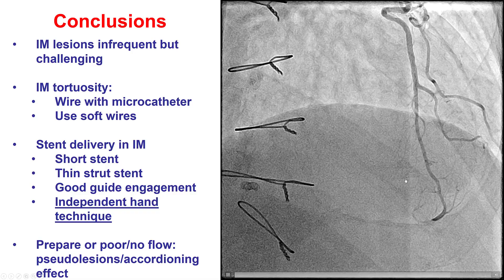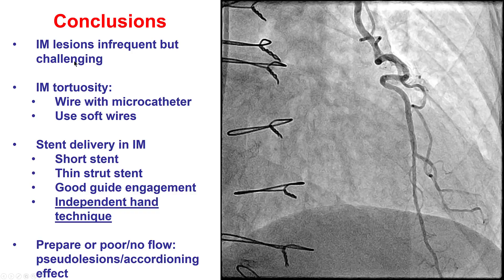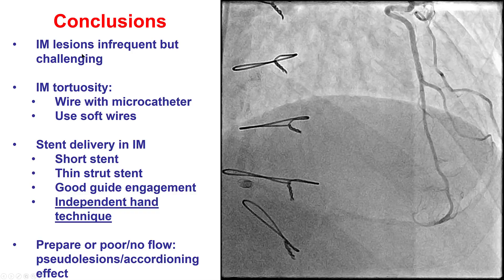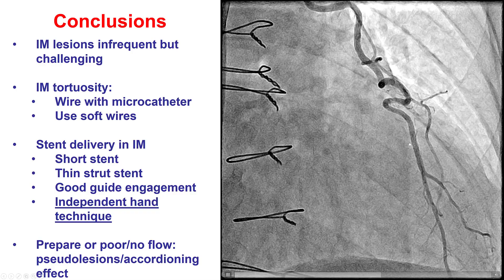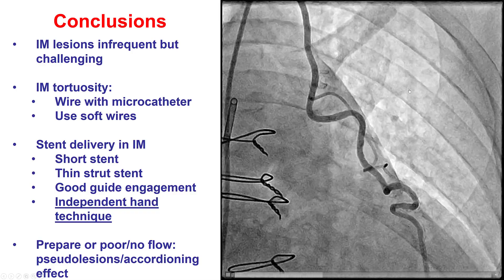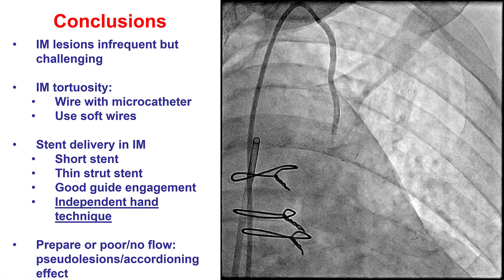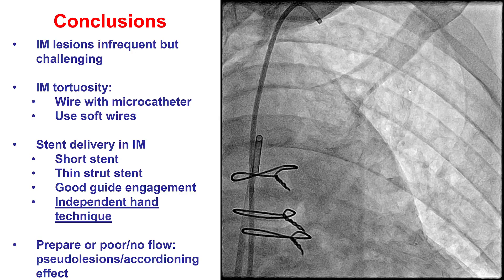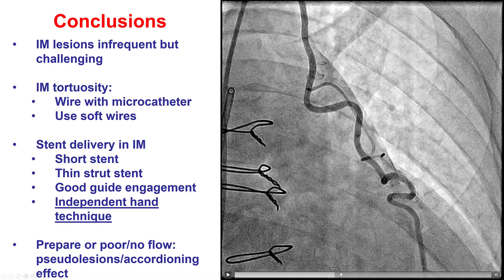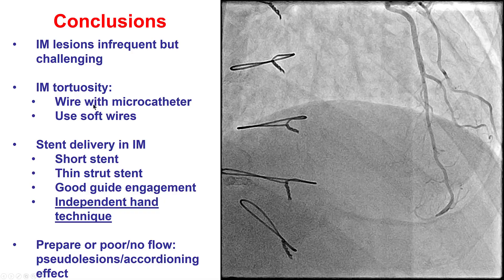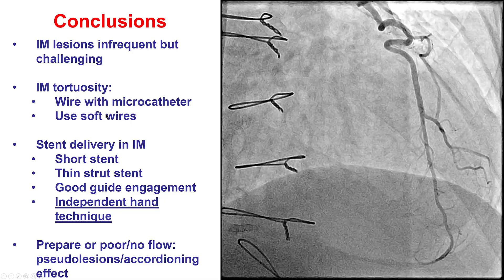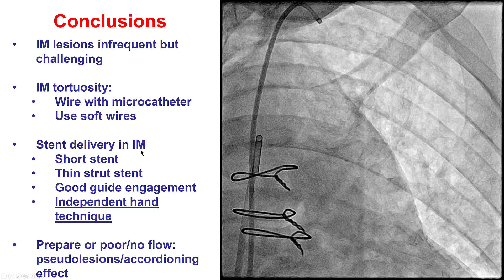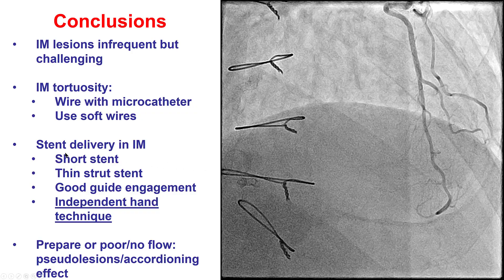So we did get a nice final result with this challenging lesion. Several lessons: the first is that we don't see this very often — IMA grafts have excellent long-term patency, but once in a while there are significant lesions, such as this anastomotic lesion, which is actually the most common location for these lesions. The second lesson is that PCI through the internal mammary artery grafts is challenging because of tortuosity. The way to tackle that is to use a soft microcatheter like the Caravel, and use soft guide wires, because stiff guide wires are more likely to worsen the accordioning effect and decrease antegrade flow.